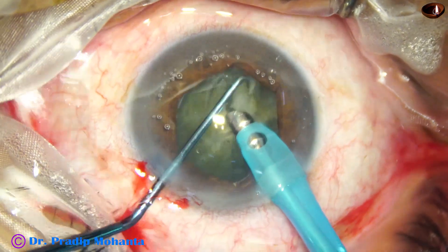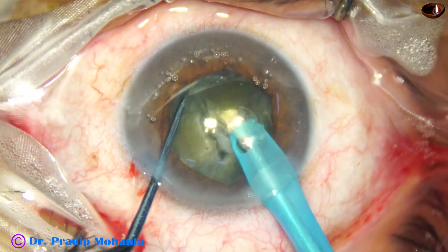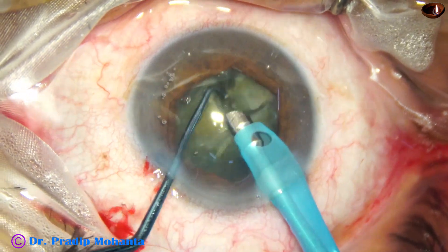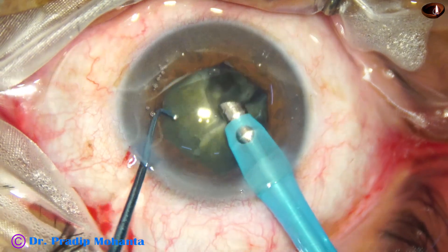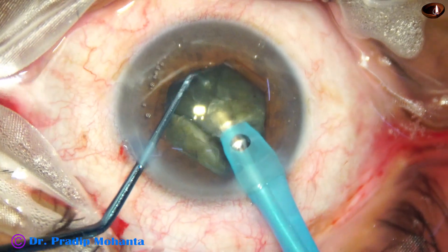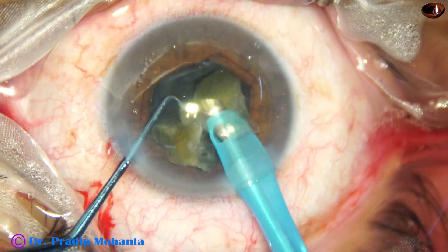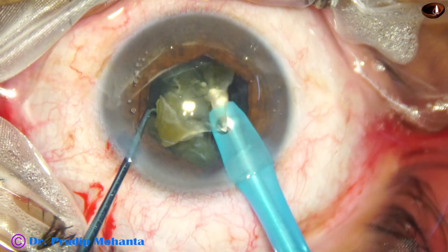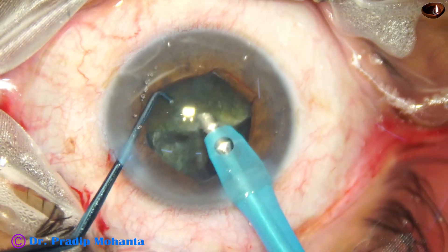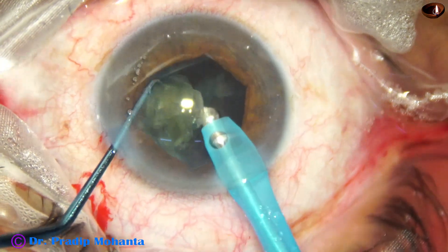We just have to go and pick up the pieces and emulsify. One piece has been emulsified, then we rotate and get the other piece and emulsify it. Ultrasonic energy being used is about 50 percent, flow rate is 45 ml per minute, vacuum is 450 mmHg. This small hemi-nucleus is divided into 2 and emulsified.